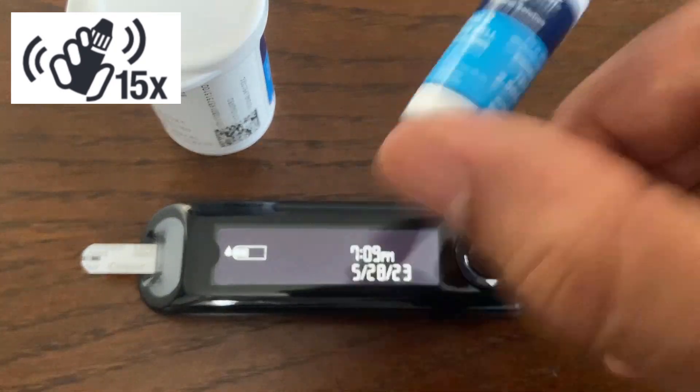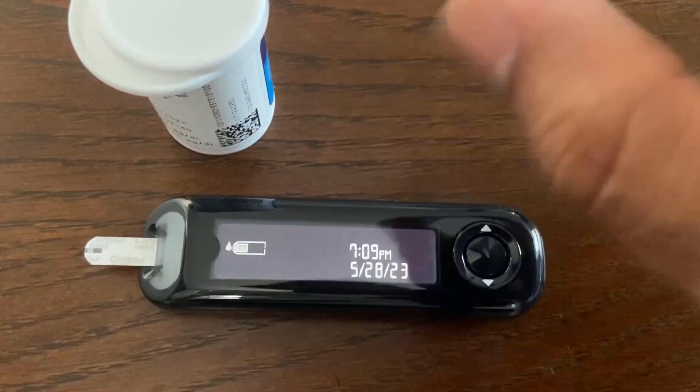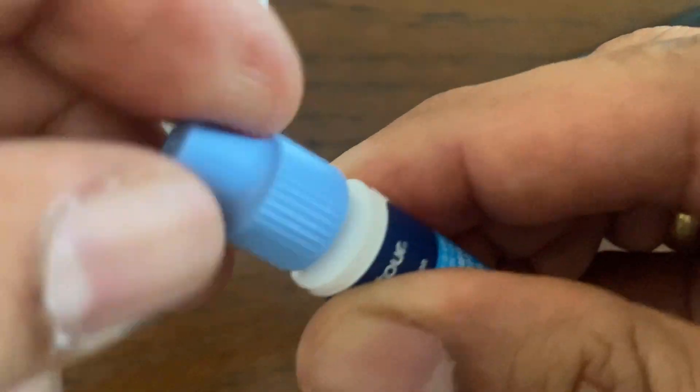Next, shake the control solution bottle well, about 15 times. Unmixed control solution may cause an inaccurate reading. Also, do not use control solution that is more than 6 months past the date you first opened the bottle. Remove the bottle cap and use a clean tissue to wipe away any solution around the bottle tip.